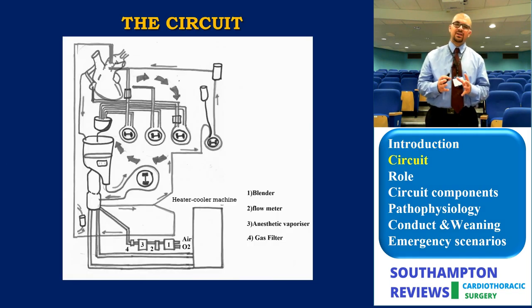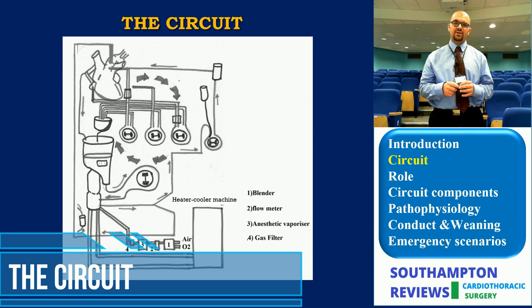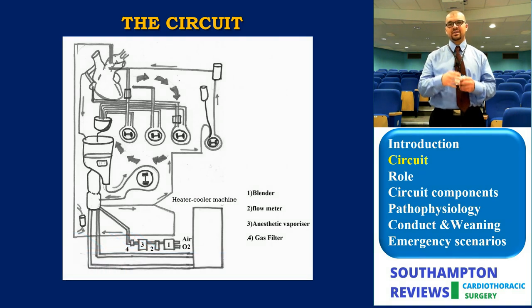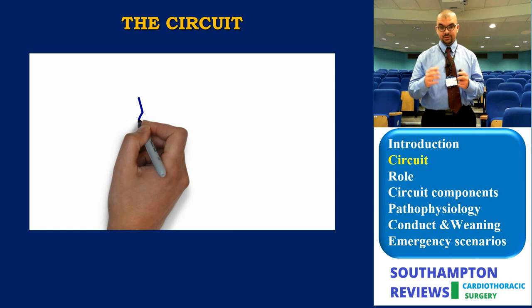Now, this is one of the very famous diagrams present in the beginning of almost every chapter of cardiopulmonary bypass in most of the books. I think it's unfair to study the circuit as one block. Halfway through, you will get lost about what is going where. I think the best way to tackle it is in a systematic manner, in pieces, as if you are a perfusionist setting up a circuit.